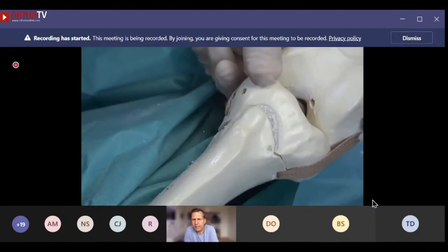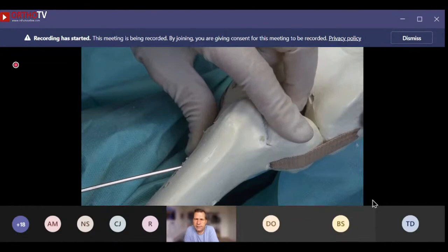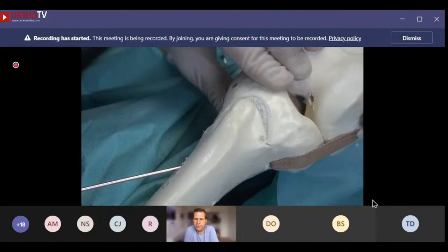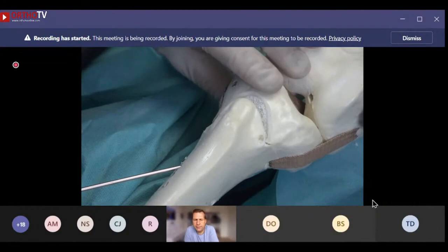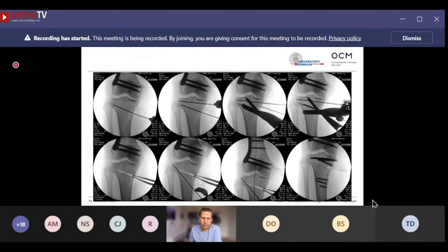In approximately 60 to 70 percent of our osteotomies involving larger corrections, we also use this K-wire preventively for hinge fracture prevention, which has proven very effective. By introducing just one K-wire, stability increases dramatically — so go for the hinge wire in larger corrections or if you are concerned about producing a type one hinge fracture.